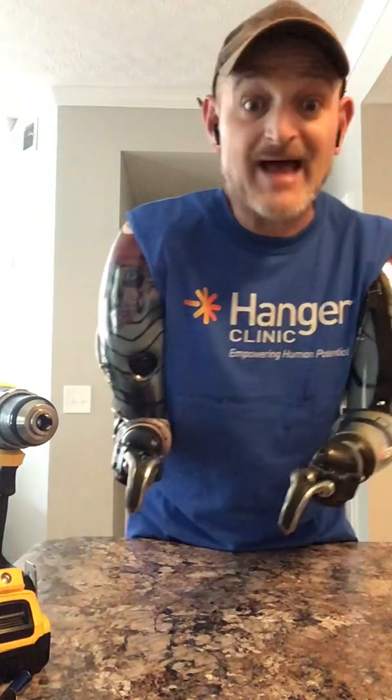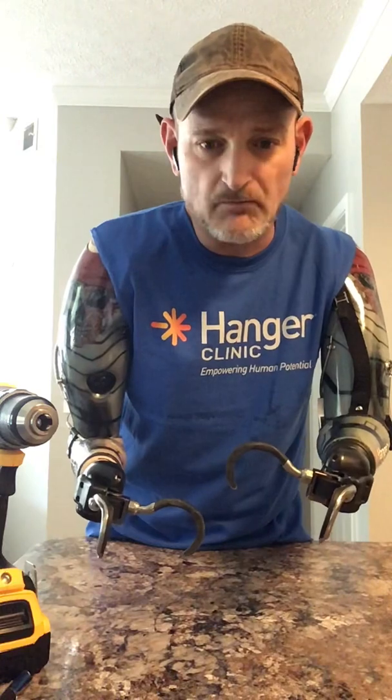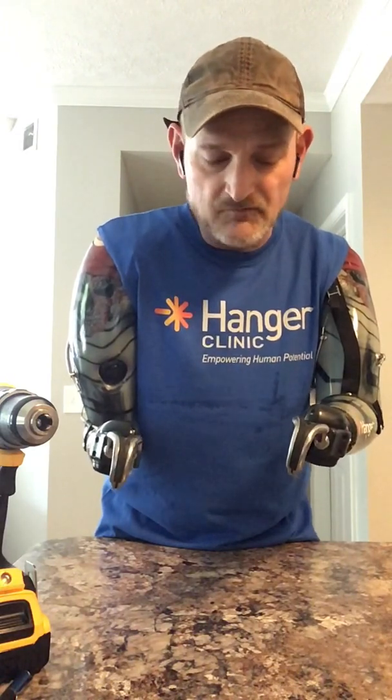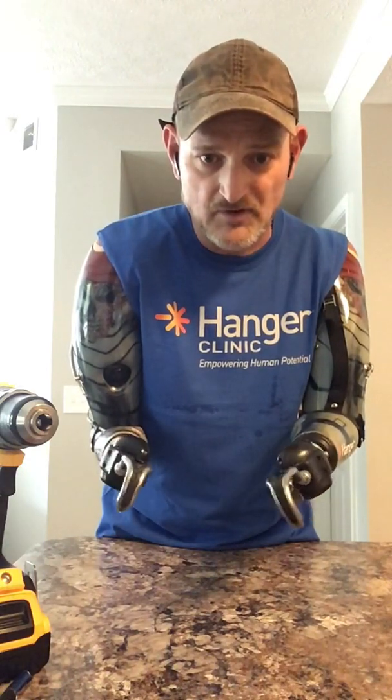I'm going to do a tricep flex on both arms — you can open them. Now a bicep flex on both arms — I'm going to close them. And I'm going to do a bicep flex and hold it — both arms — to make the wrist rotator spin. You see how they spin? That's bicep. Now I'm going to do the same thing with tricep — tricep, both arms. That's how they work. Tricep and bicep work out pretty good.